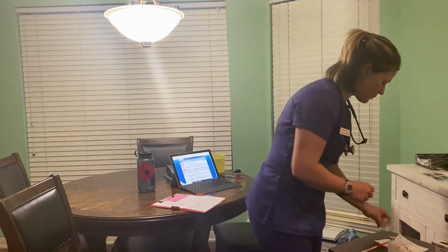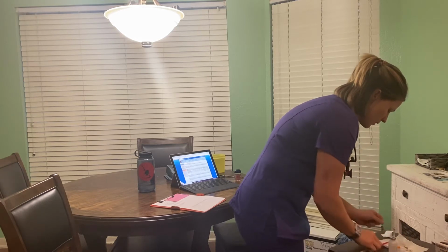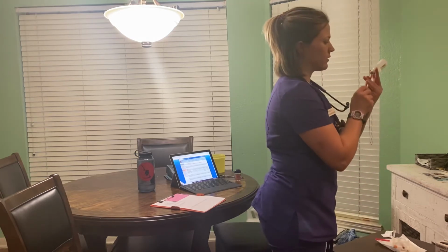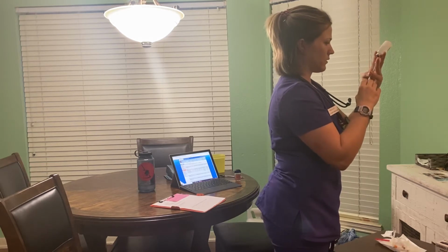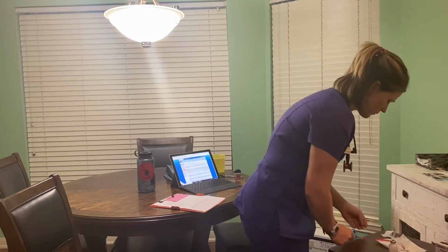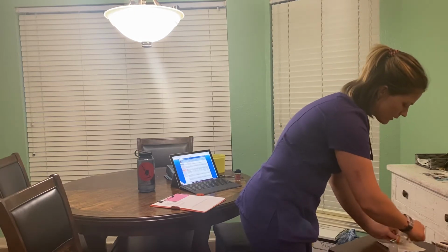Okay, I'm going to go ahead and draw up my heparin. Okay, cleaning that. Okay, I'm going to use a blunt needle to draw up my medication. And then I can put that in my sharps container, and I put the clean needle on.